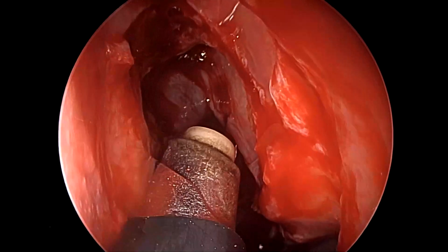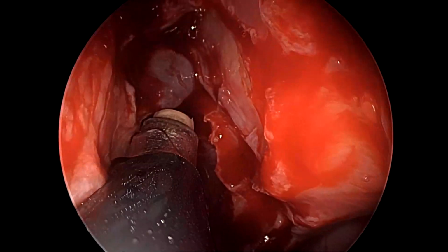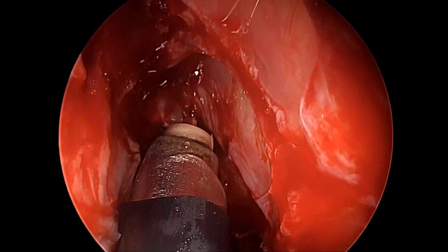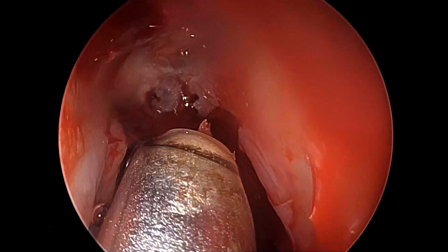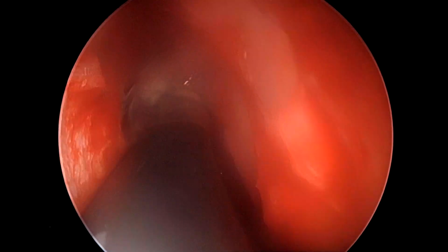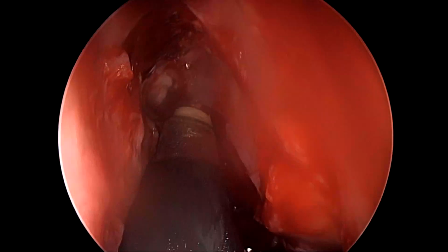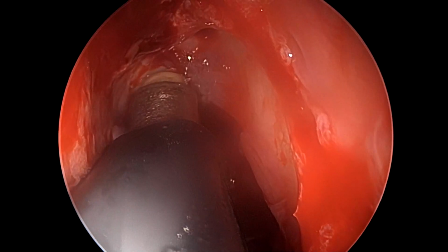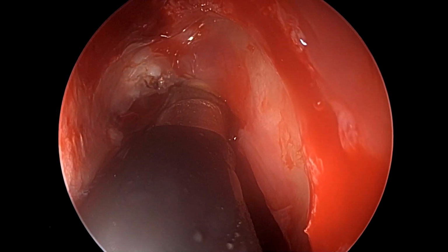So as we approach close to the meningocele now, with all the mucosa hugging it, we shift to our coblator wand. This is an EVAC 7-3, a standard ArthroCare coagulation wand. And as you see here, we immediately put it to use, in coagulation mode initially, on the meningocele, and as soon as we do it, it immediately shrinks the meningocele and brings a much more clear perspective into the picture, because our purpose is not the meningocele but the skull base defect through which it is protruding.